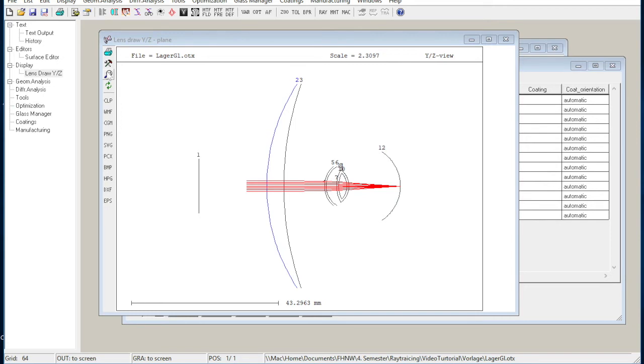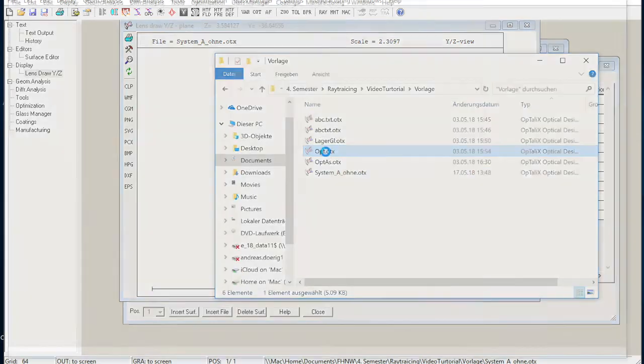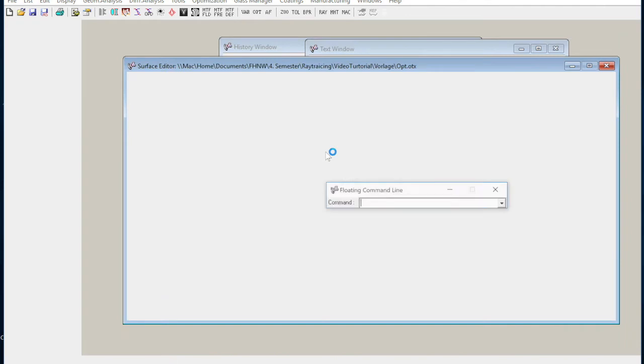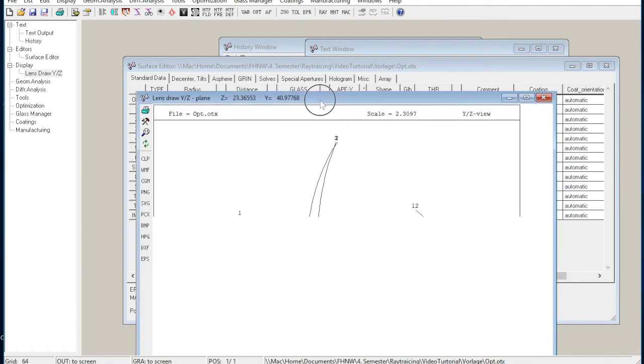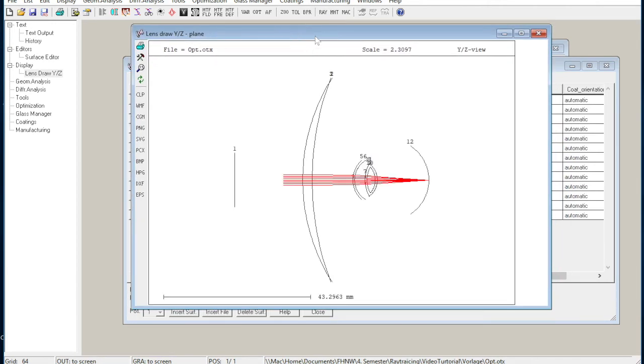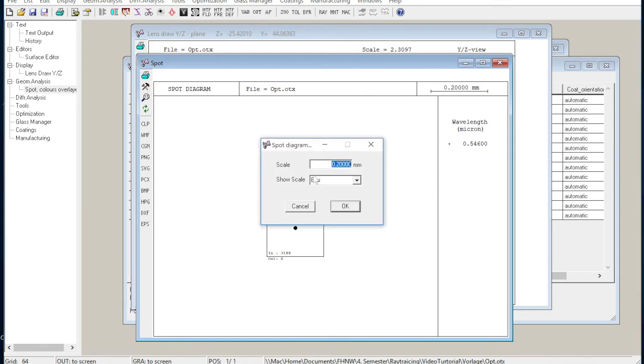What we want is a nice, thin and flat lens, so we need a new lens. We allowed ourselves to prepare such a lens in advance. And there we are. What did we change? We made the lens thinner by increasing the refractive index up to 1.74, and therefore we also needed to change the radii. And here you are. This is our nice thin spectacle lens. Here on the spot diagram you can see that we have a nice depiction on the retina. Just change the scale to the one we had before and you can see it even better.